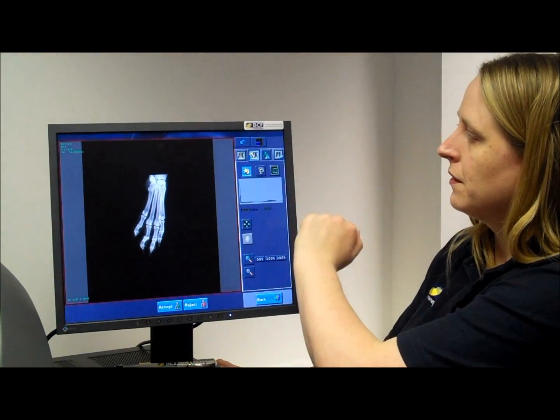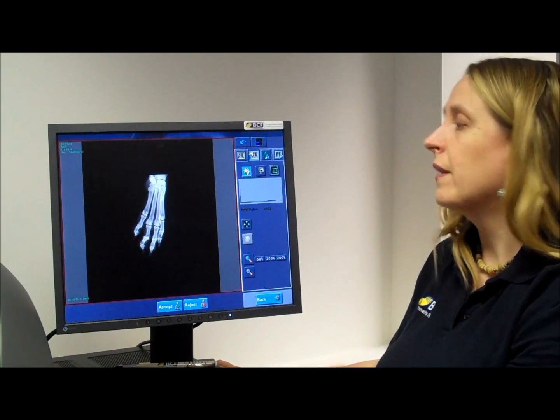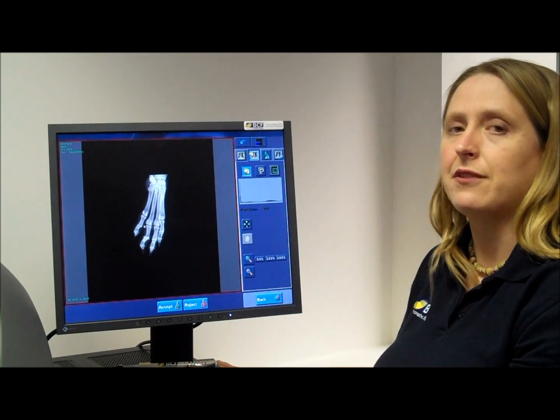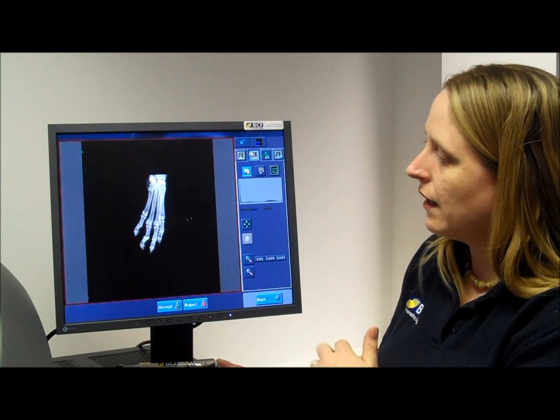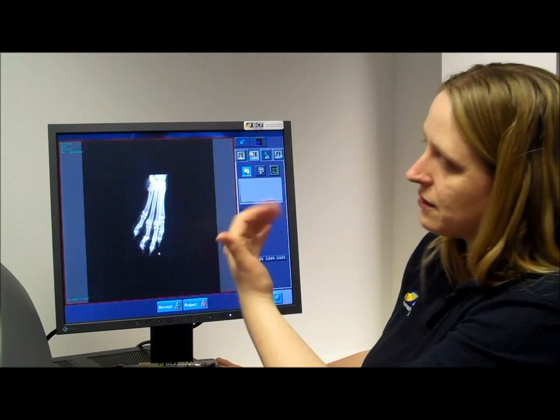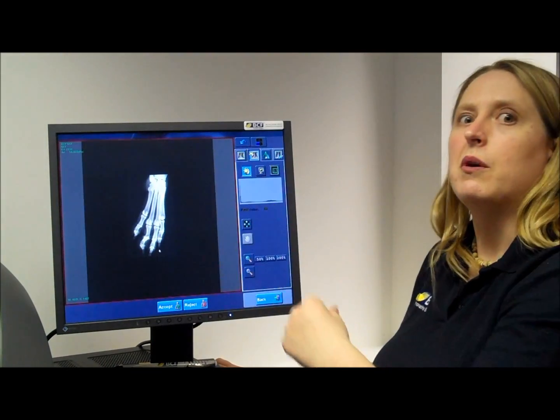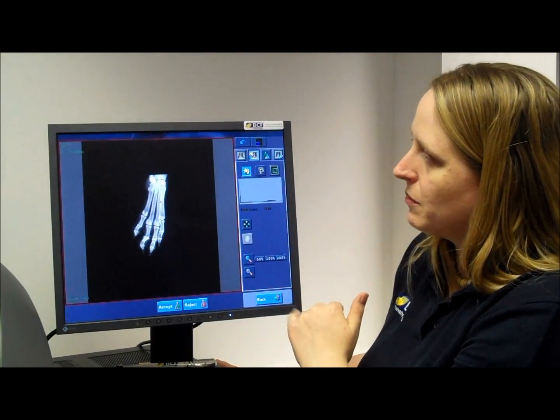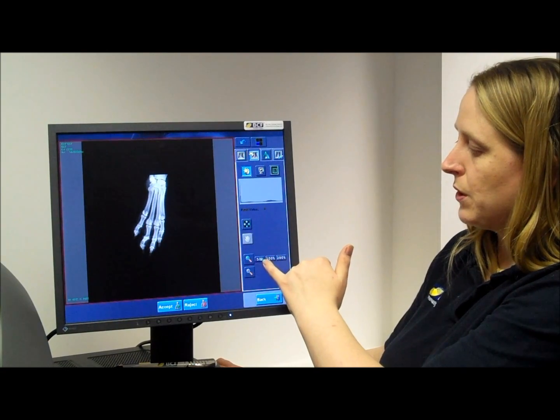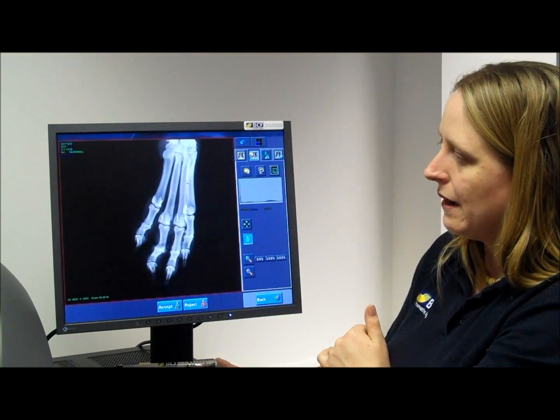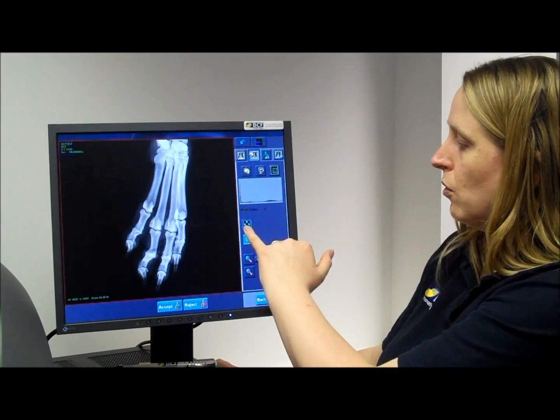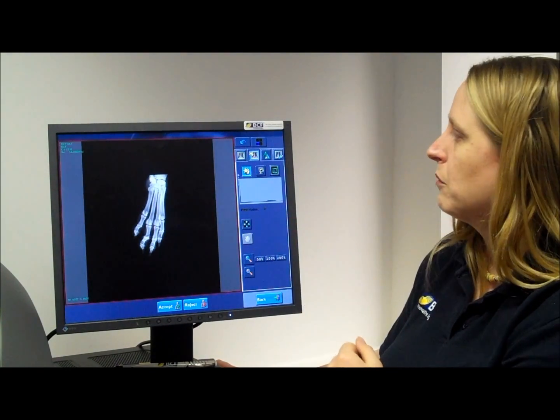The next screen across takes you into your windowing. This is useful if your exposure's slightly out, so you can just tweak the picture — and you can see the background changing as I'm playing. As it's quite a nice exposure, I won't make too many changes; I just want to make sure it's nicely balanced. Additionally, at this point, I can magnify the picture up and pan it around if I want to look at one area closer, or just return it back to how it was.